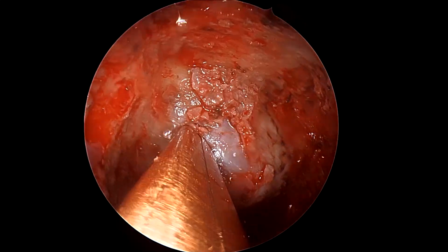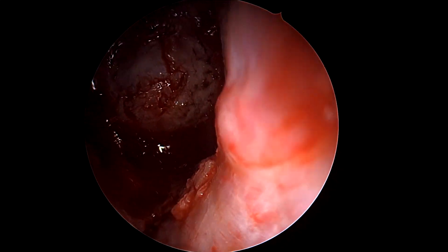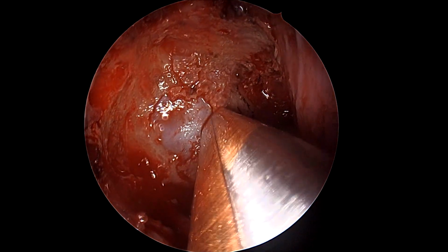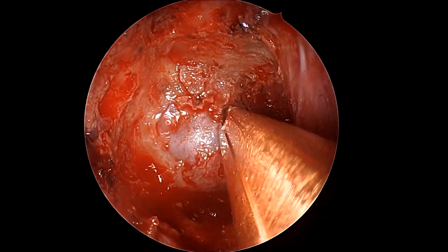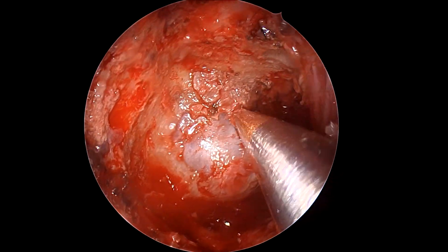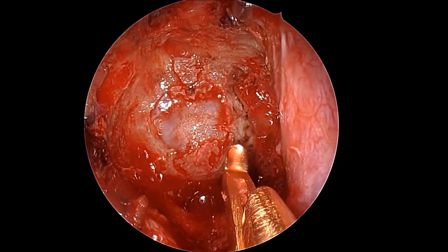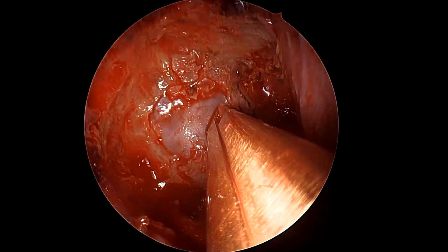In this instance, there was some technical issues in uploading of the MRI films in the navigation systems that left us in a little bit of a dilemma because on a CT, we didn't do a CT angiography. It was a non-contrast CT, I think, and that really does not show any interface between the tumor and the carotid, so it's of not much value here. And the MRI was not getting loaded.